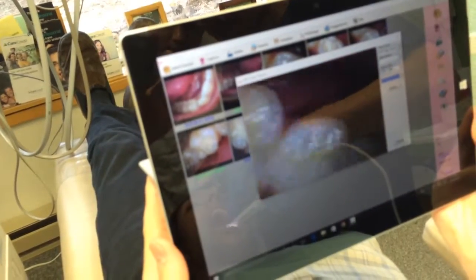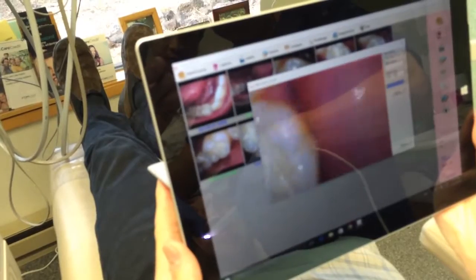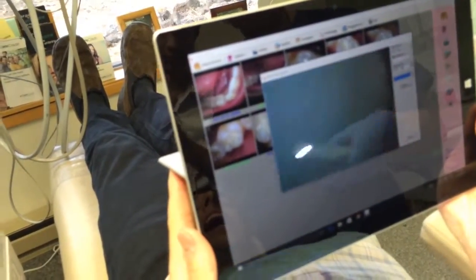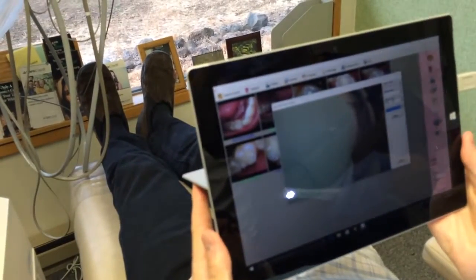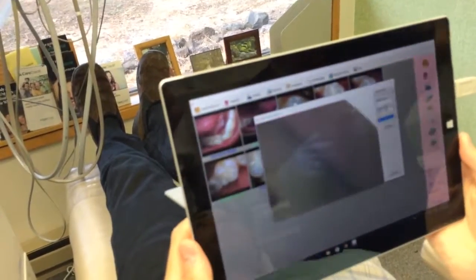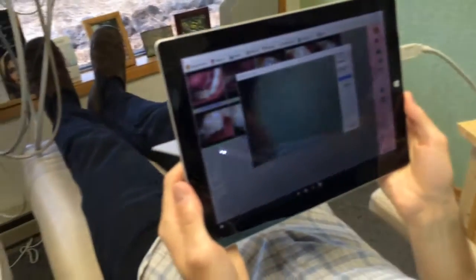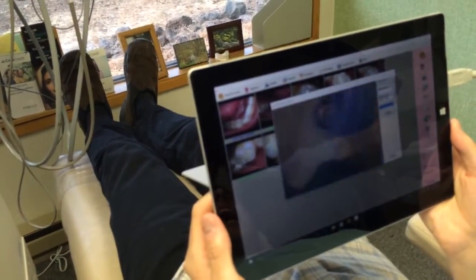I could even take pictures while I'm doing the preparations, to show what it looked like. I think this is cool, and if we want to, we could mount it up. I think it's going to be best if the patient holds it, because it has a bigger impact when the patient's holding it in their hands. It's almost as if they're feeling the crack, and if we can make them feel the crack, that's what we want to happen.